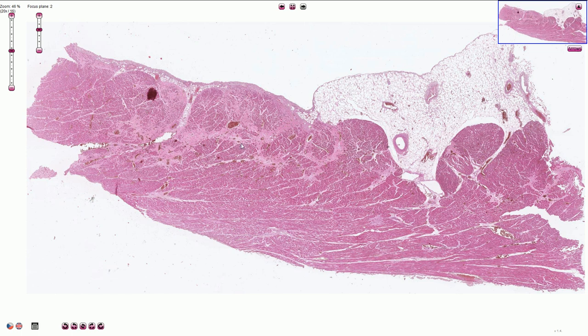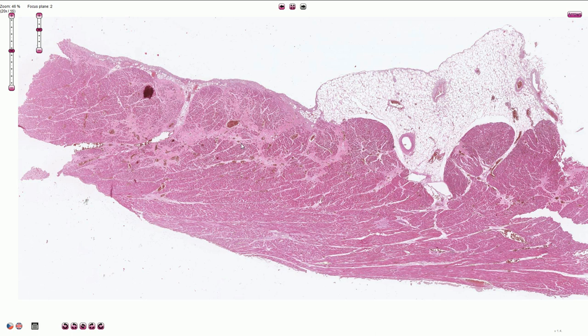Dispersed myofibrosis is commonly associated with ischemic heart disease, hypertension and myocardial hypertrophy caused by prolonged hypertension, and also with heart failure.